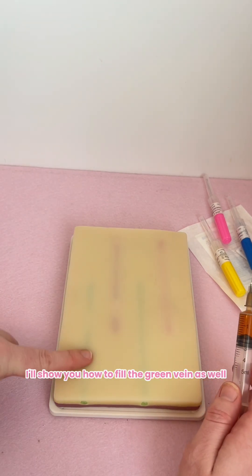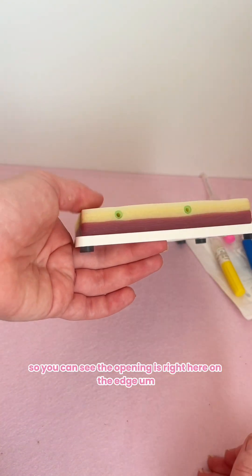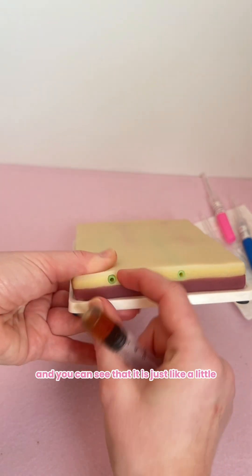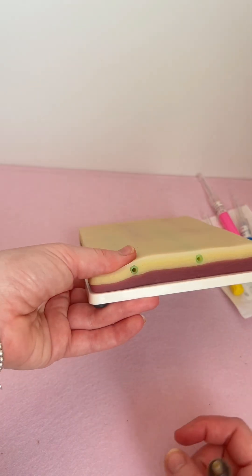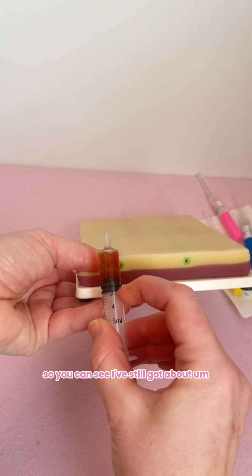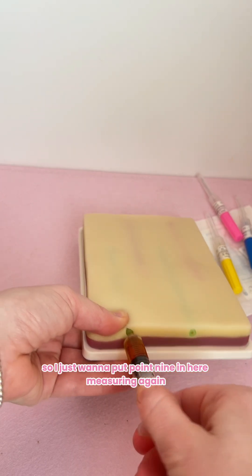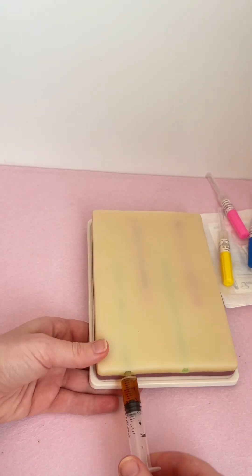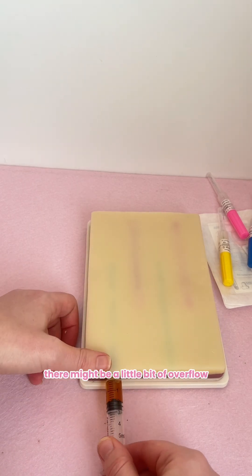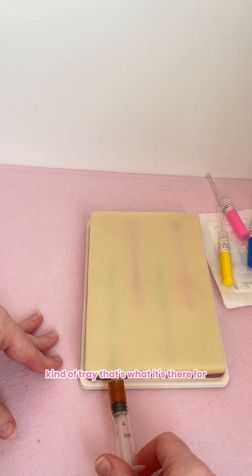I'll show you how to fill the green vein as well. Remove my needle — make sure you're very careful with your sharps whilst you're at home. You can see the openings right here on the edge. I would just hold it to occlude it, and you can see it's just like a little tubing in there. Hold it firm — this fits your syringe nice and snug. I've still got about a little bit over two mils in there, so I just want to put 0.9 in here. Fill, fill, fill — with this one there might be a little bit of overflow, but it's just going to come out and sit around in this tray, which is what it's there for.